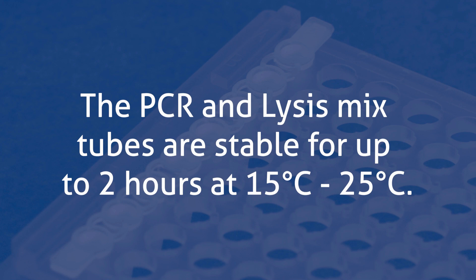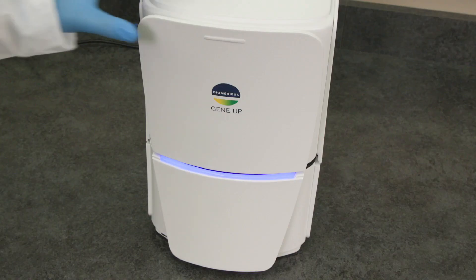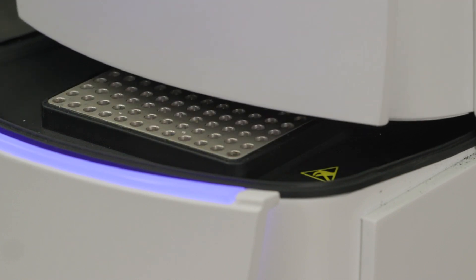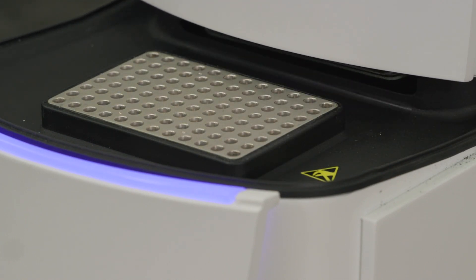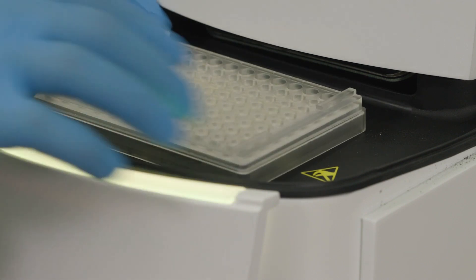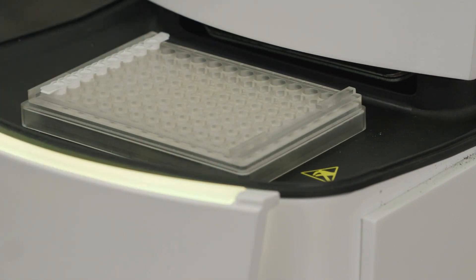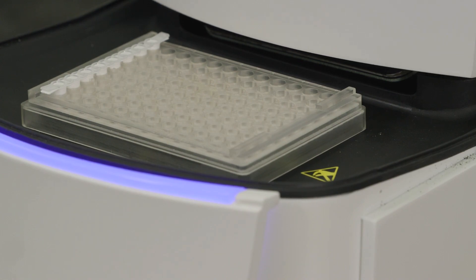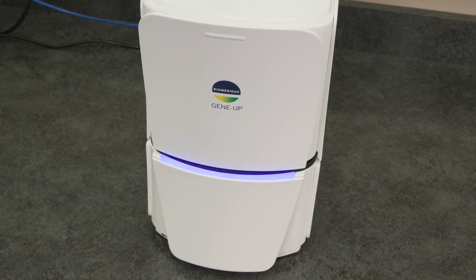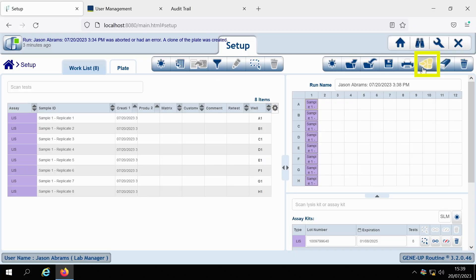The PCR and lysis mix tubes are stable for up to 2 hours at 15 to 25 degrees Celsius. Place the tray into the heat block of the thermal cycler, making sure to line up the A1 position from the PCR tube holder to the A1 position on the heat block. Push down on the four corners until you hear the click and the tubes are free from the plate. Close the door and start your run in the software.